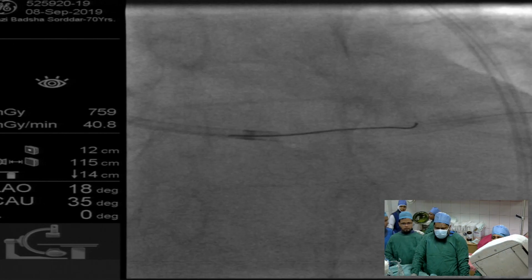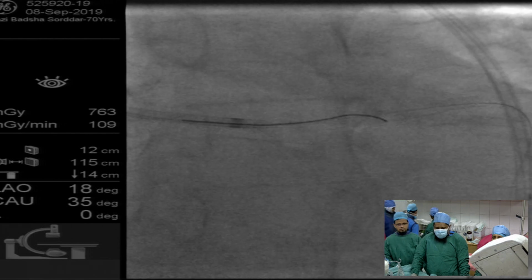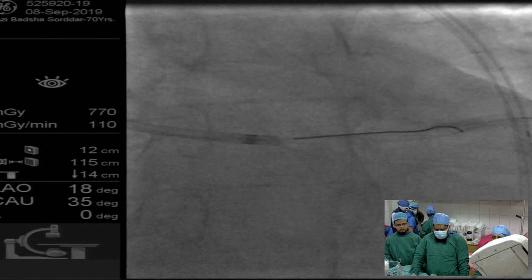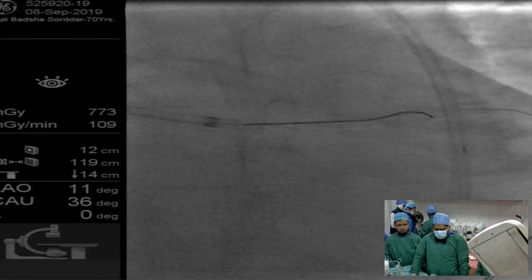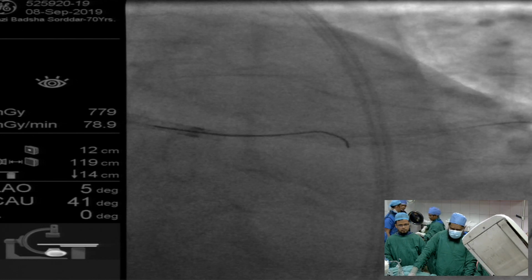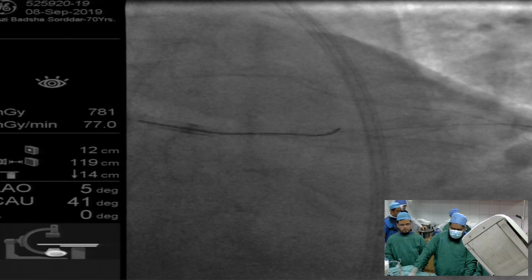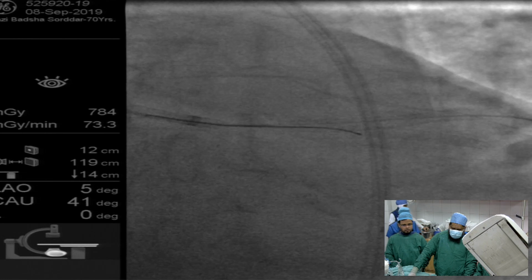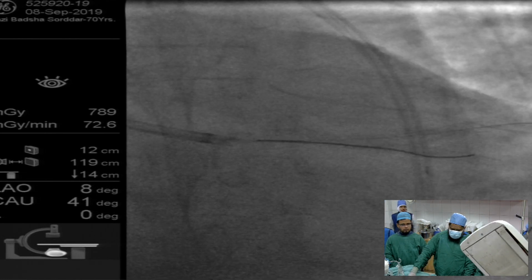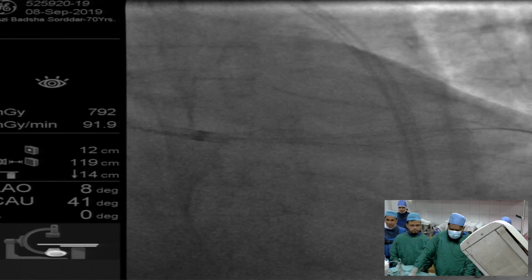So we've got 2 choices: either take a micro or take a new wire. So it's going there, but it just doesn't have the strength to go through, right? So can we have a micro, please? It's almost in. Okay, so it doesn't want a micro, it went by itself.